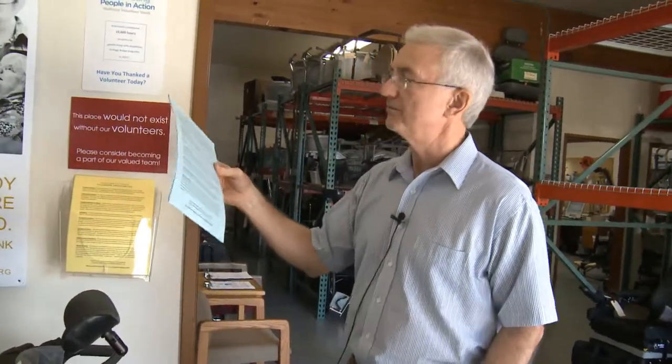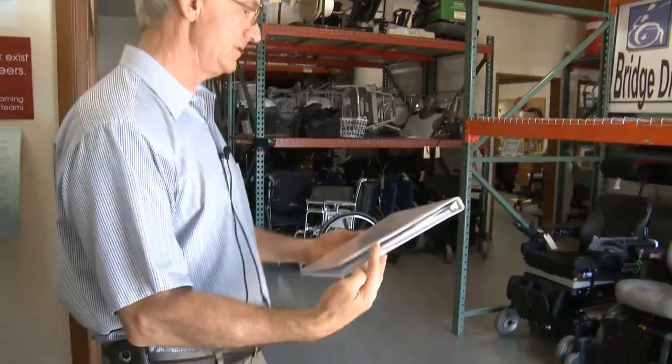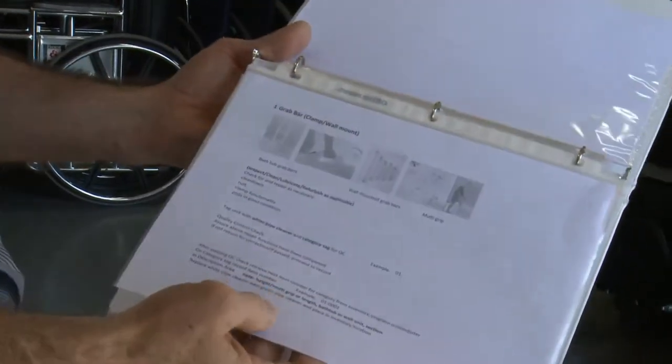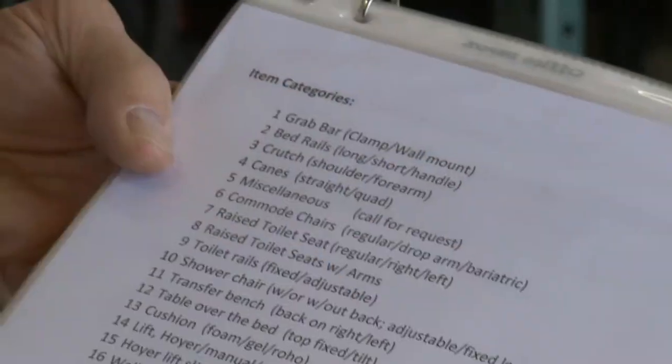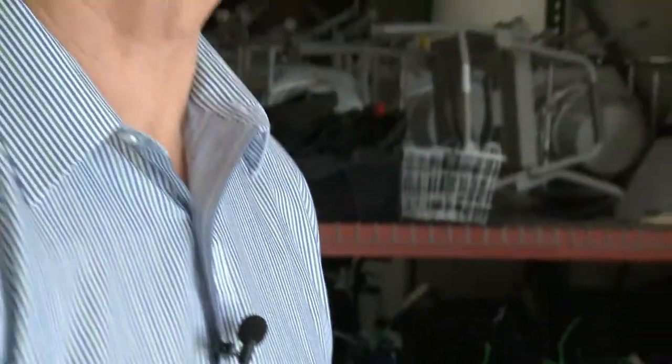We have a little list of things we give out for people who want to know what to expect if they volunteer, and we try to come up with a good range of job descriptions. We also have a notebook that tells volunteers about different types of pieces of equipment — about 20 or 25 different pieces, from grab bars, to toilet rails, to Hoyer lifts, to manual and transport wheelchairs, power wheelchairs, and that sort of thing.